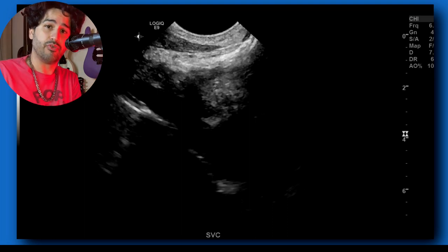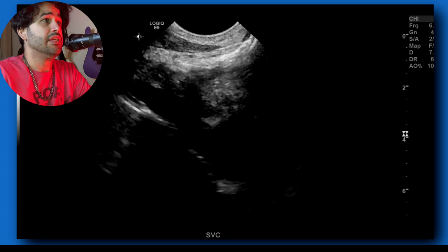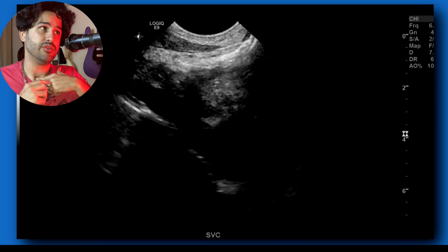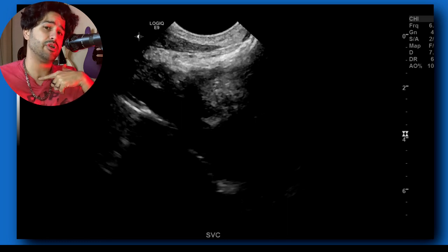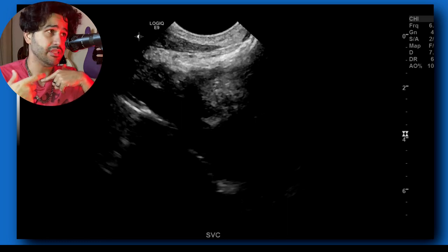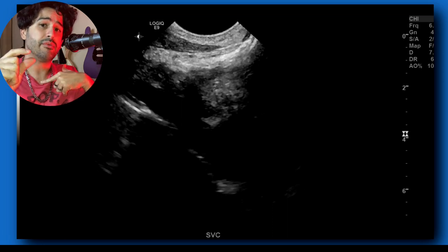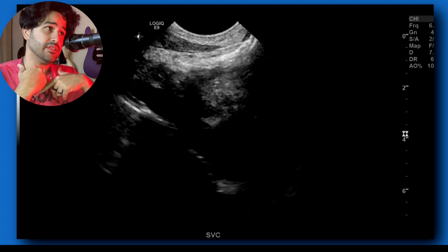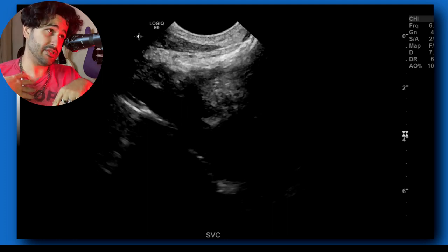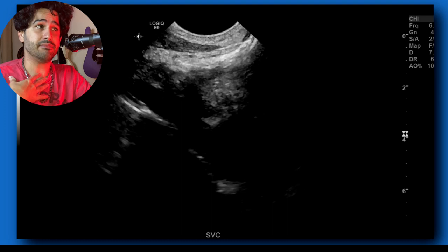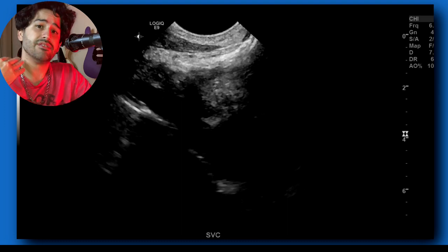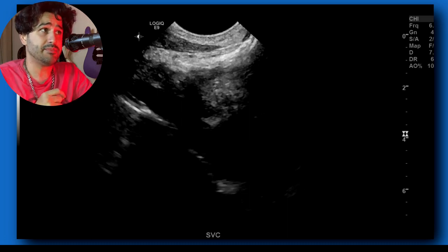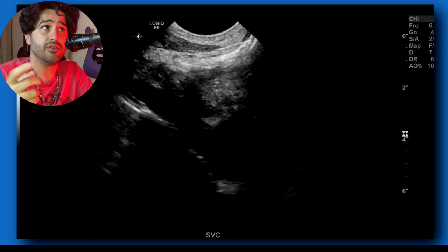They had a peripheral IV line that they removed. When I begin this exam, I begin right here in the suprasternal notch. I use either the curved probe — the C65 or similar — in bigger patients, or the smaller microconvex array probe if they're skinny. If they're really skinny, I even use the linear. Sometimes you'll have a hard time getting the vessels in the chest. Not every place begins there; some places begin at the jugular vein and then work down through subclavian.